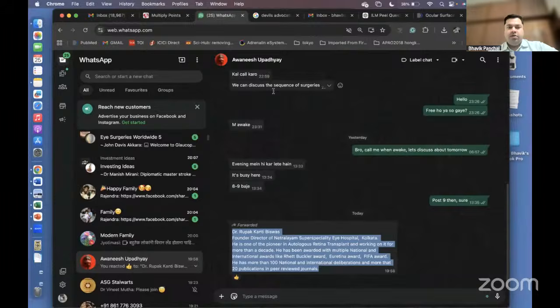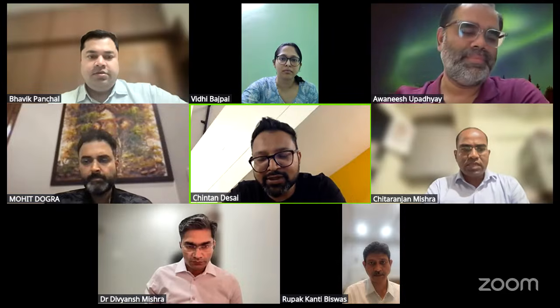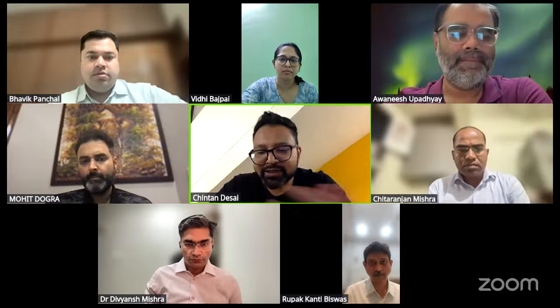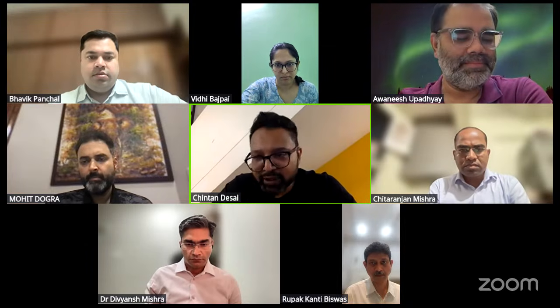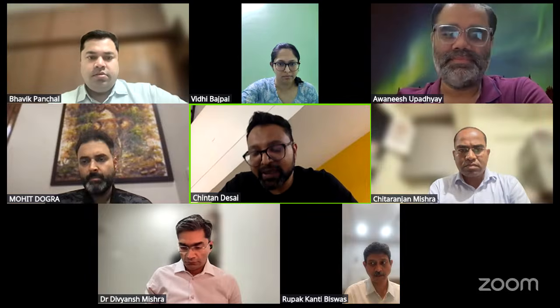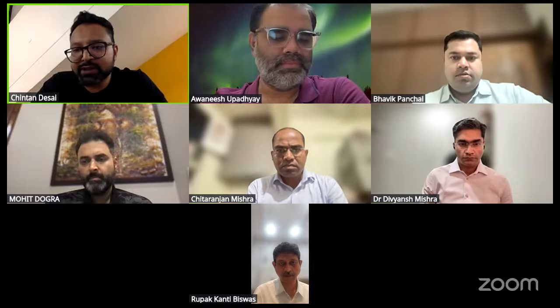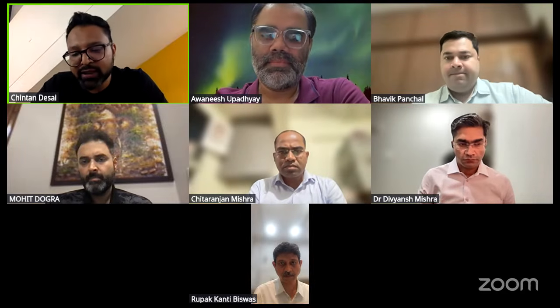Okay, great. So can I just offer my 2 cents on the discussion? Yes, please. I understand and respect all the views, and I understand where you all are coming from, and why you feel that there is no need. I agree that probably 95% or 98% of these holes would close without using PFCL.